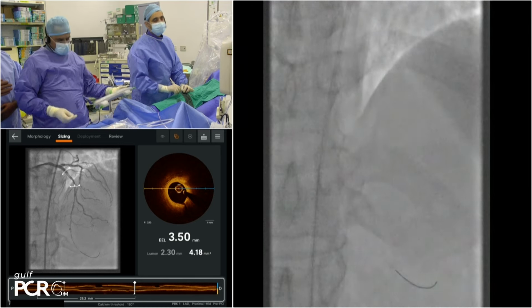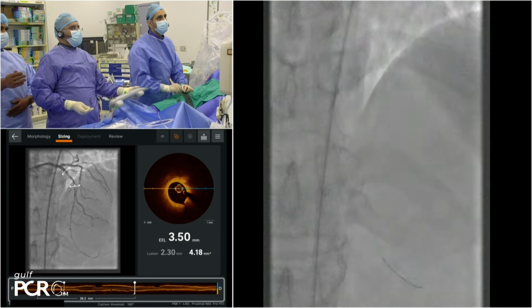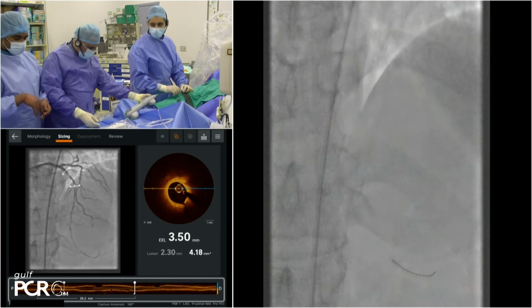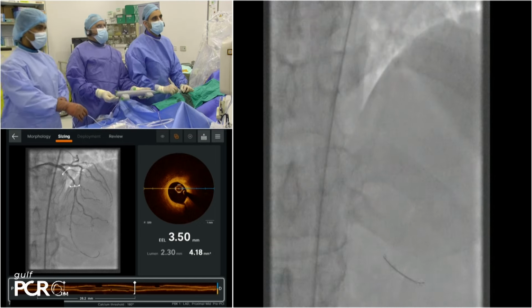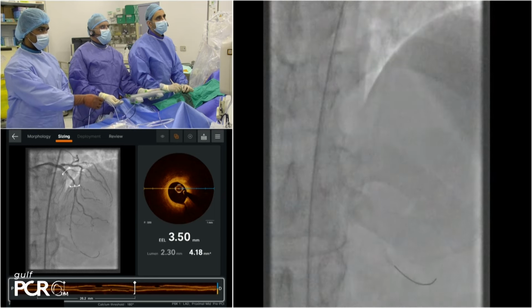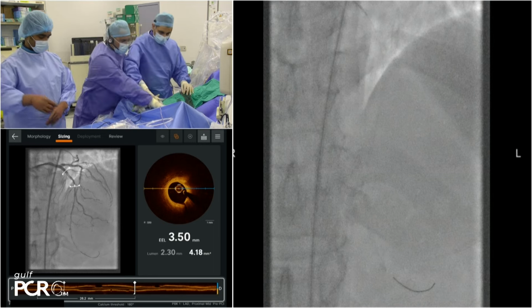Stop. Maybe while they're advancing the orbital, we ask the panel here about what they do. Maybe ask Hussam. Regarding calcified nodules, you love them, I know. They're my enemy. So what is your take on calcified nodules? How do you approach them?